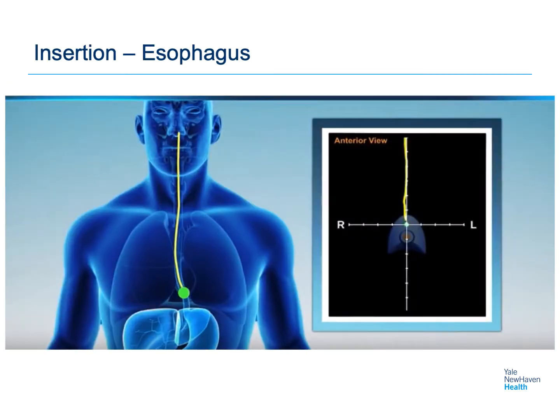This slide shows what is the preferred view of a tube being placed through the nose and into the esophagus. You'll commonly hear people talk about a vertical drop. And on the right side of the screen here, you see that straight vertical drop down to really the intersection of the X and the Y axis. And that's what you want to see when your tube is going in. If this tube was to have changed course earlier and you didn't see the vertical drop, you would be concerned about it being placed in the lung.